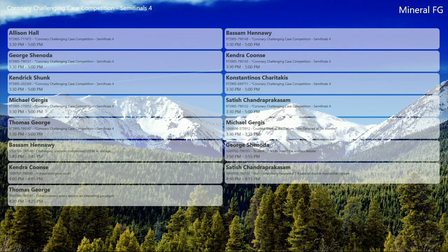May I ask one question? Had this patient had any form of ischemic evaluation? And why did we stent the left main? There was significant disease in the left main. We also did an IVUS, but I'm not able to run it. This patient had NYHA class 3 to 4 and was getting repeated ischemia-induced LVF with frequent admissions, both for unstable angina as well as heart failure.